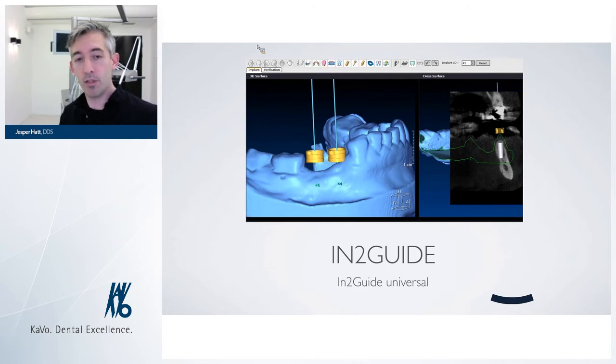And here you see the level of the sleeves that are placed in the surgical guide. And as you can see on tooth number 44, it goes a little bit into the soft tissue. Now, with as little soft tissue as this, it's possible to fill a little bit around with the soft tissue. You can use a laser, cut away a little bit, or you could just press the guide into position if you want. But you have to have a little bit of experience to find out if this is possible or not.